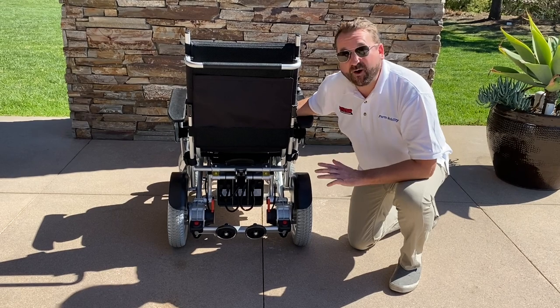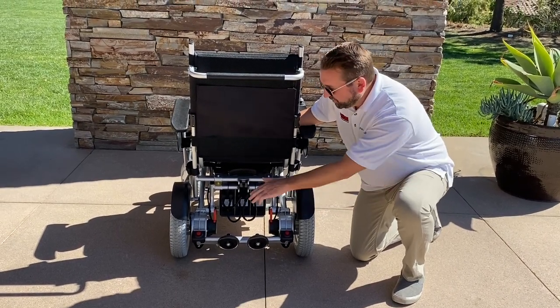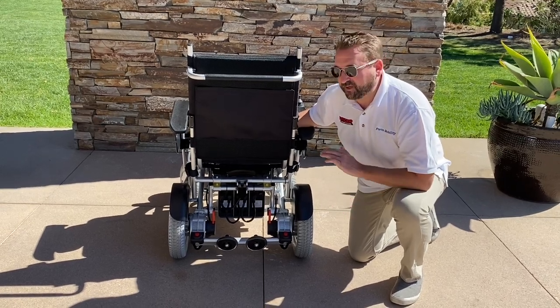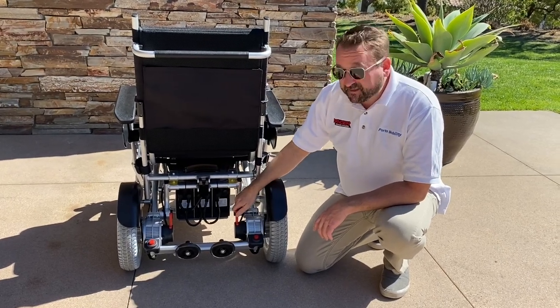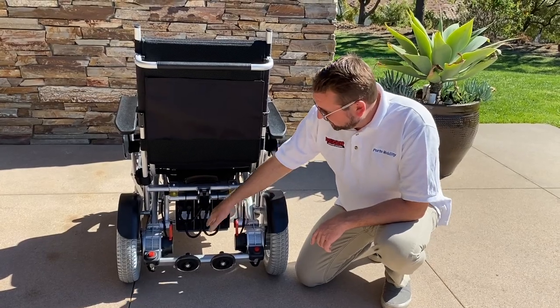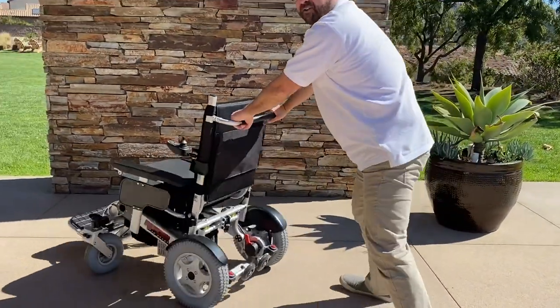The Beast has the most powerful motor of all the Ranger series. It's got dual motors on each side of the wheel that are 500 watts each — that's 1,000 watts total, which will challenge any kind of terrain. Like all the other Ranger series, when the brakes are on it's in electric mode. To put it in manual mode, you simply unlock them by pressing the red levers forward, and then you can push it manually.